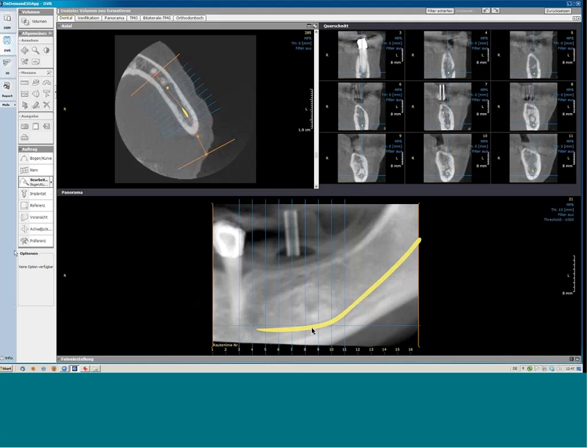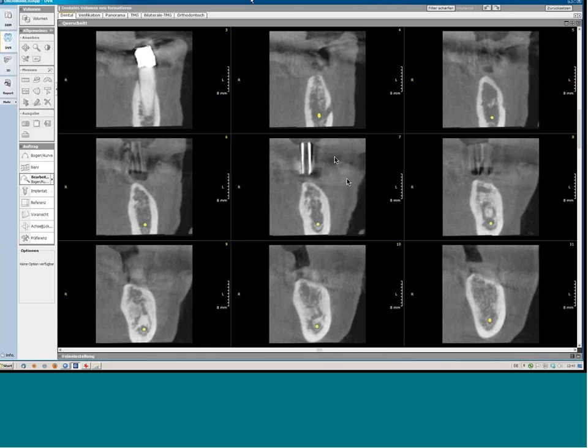I made here this marking of the mandibular canal in this on-demand 3D software, and finally the cross-section reference images, these are the blue lines here, are going straight through this cylindrical shape here, and in the next image we can see that here you can really nicely observe the, let's say, planned implant axis, where you can evaluate if this tube or cylinder is useful for further implant placement purposes or not.